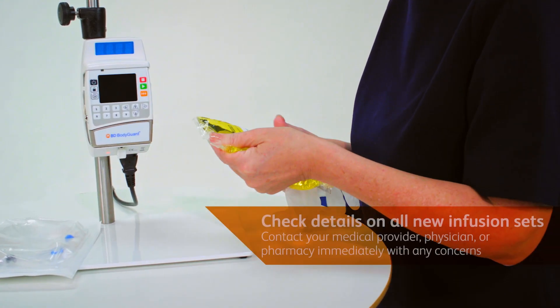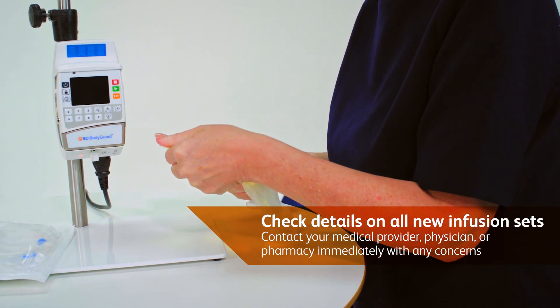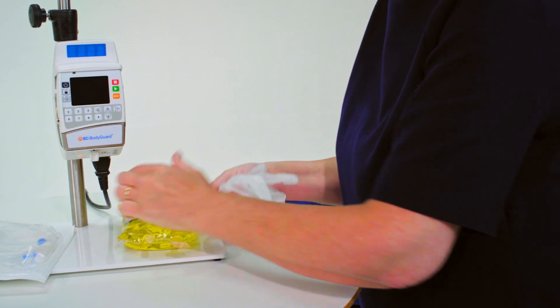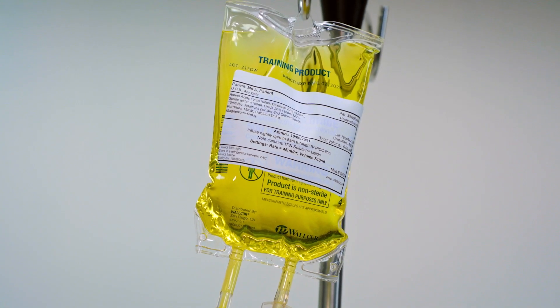When receiving new IV bags, always check the bags match your details and prescription. Should you have any concerns, please contact the medical provider, pharmacy or hospital immediately on the phone number provided.